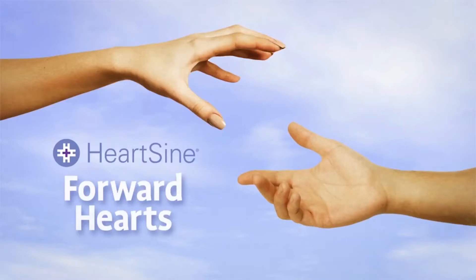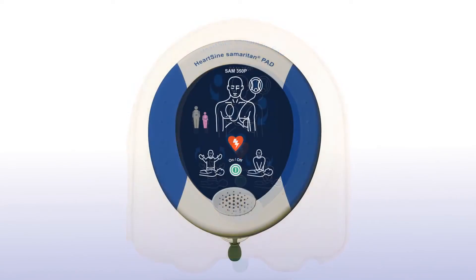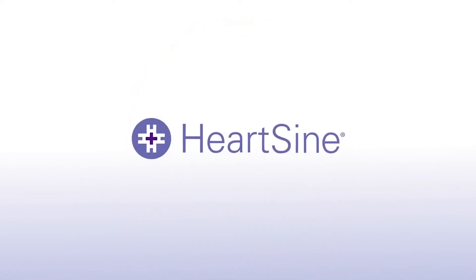With a unit nearby, you are always prepared to respond in the event of someone going into sudden cardiac arrest. HeartSine — life-saving, pure and simple.